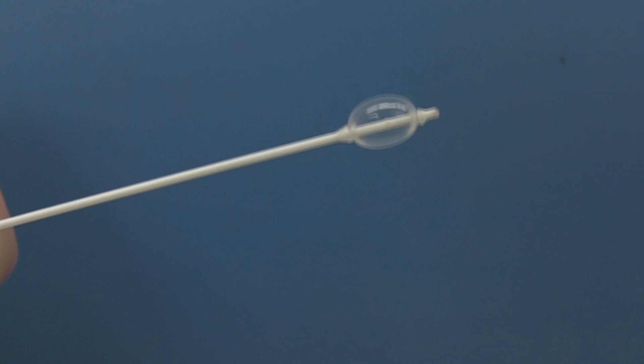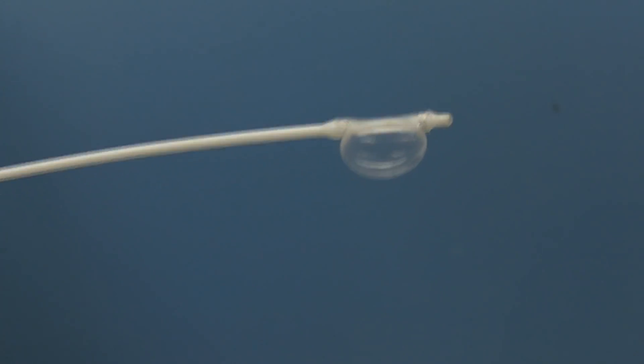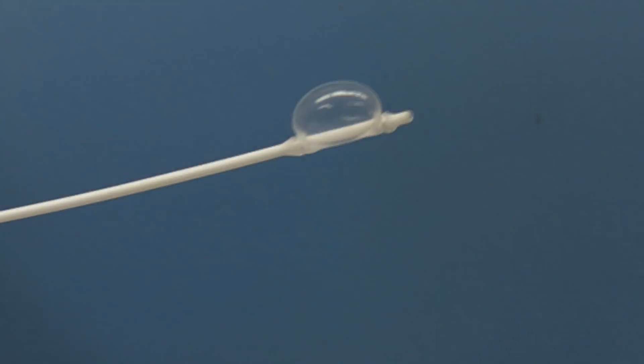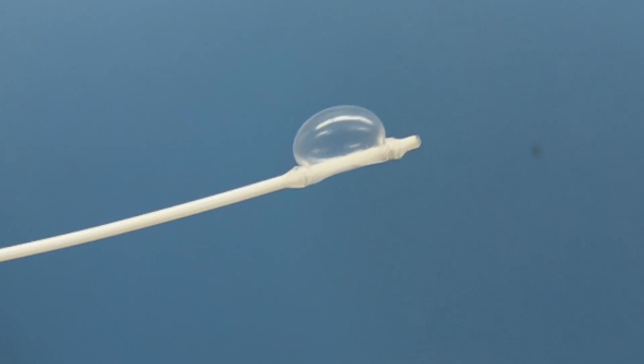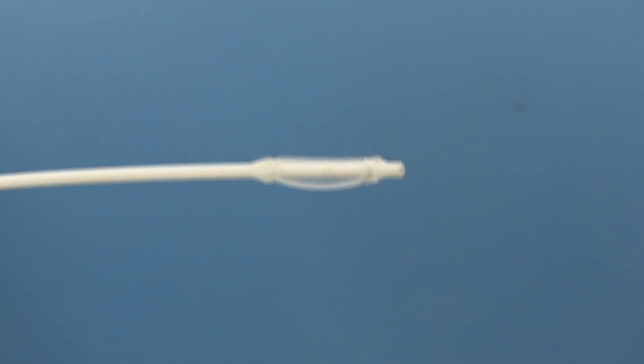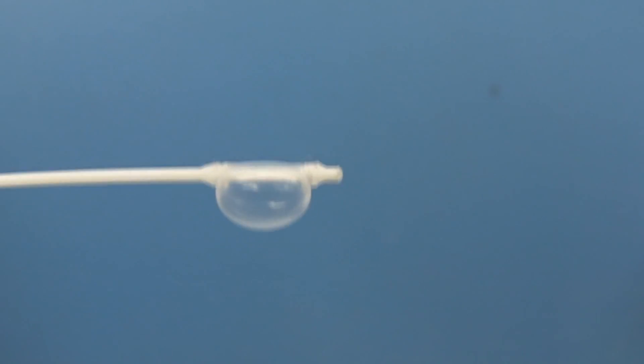So what we're going to do today, we're actually going to try a prototype asymmetrical balloon catheter extractor of foreign bodies. This is made by a company called MarMed, and we actually have a volunteer who's going to let us try it.